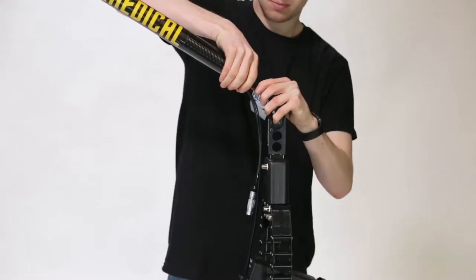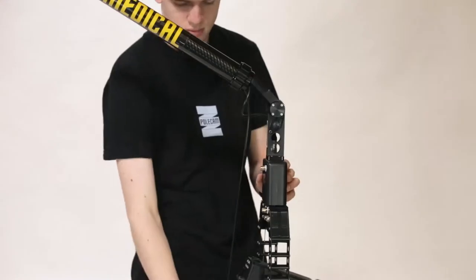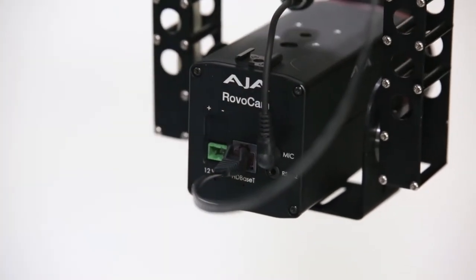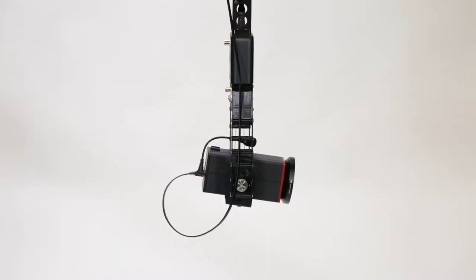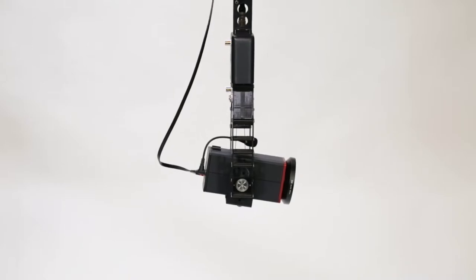Connect the head control cable to the head, lining up the red dot on the cable with the red dot on the port, and connect the Cat5 cable to the rear of the camera. Now go to the rear of the system and pull back any excess slack in the ethernet cable, ensuring that you have enough slack to perform any desired movement.